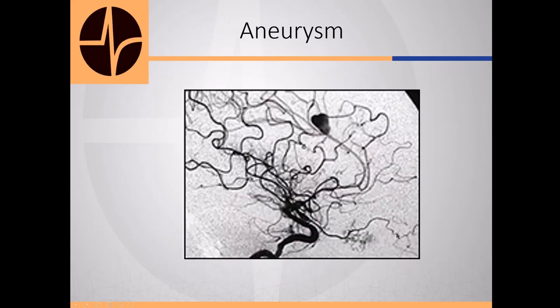An angiogram. With an aneurysm, you don't ever have had to look at an angiogram or have been taught how to read it to know this ain't right. There's something missing. Something's wrong here. That's that bulge in the inner tube.